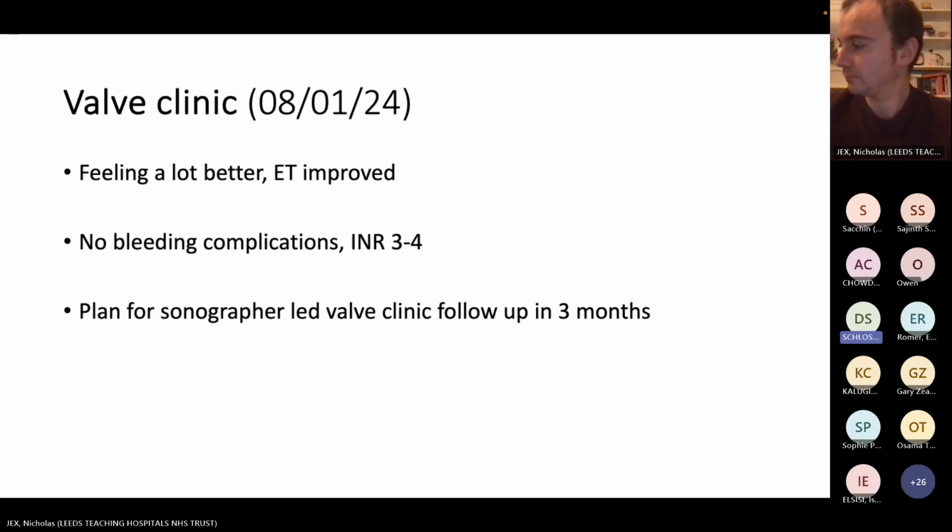So in this case, it was first, is it obstructive or not? Yes, it was. And I was nervous. I saw him in clinic, and I actually was thinking of admitting him, and giving anticoagulation, but these people have little reserve, because if it doesn't work, then the gradient goes up, and as you could see, his gradient was 5.7. So it was a bit tricky.